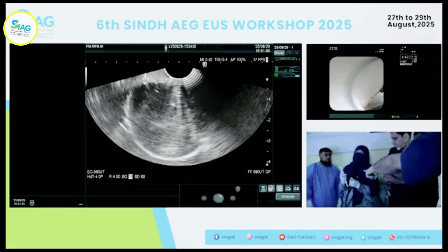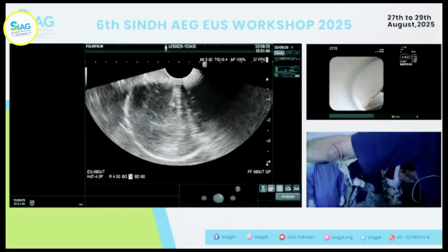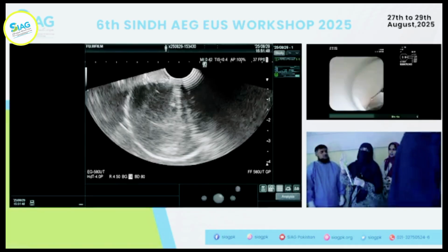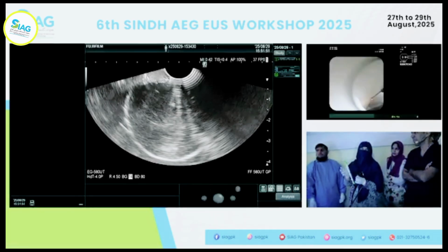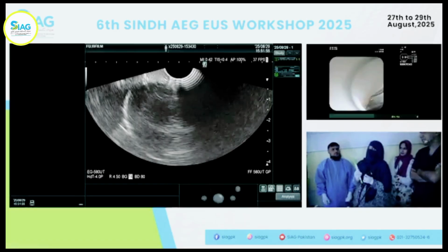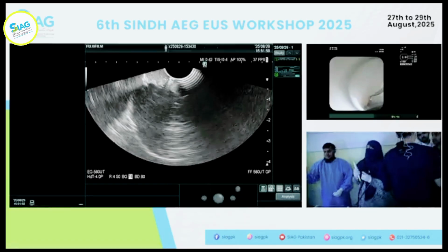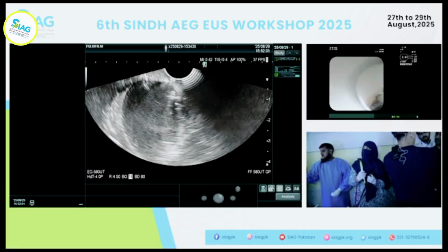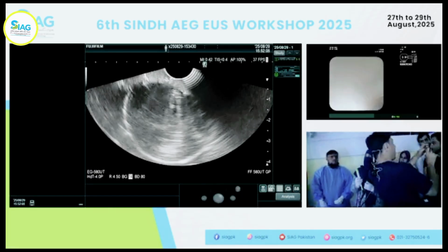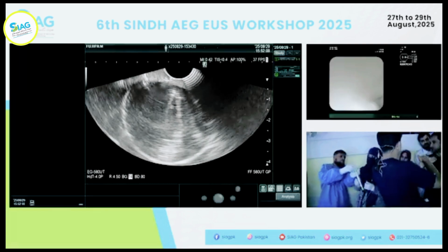This is a point. If you're not sure, you can measure your distance from there, measure that distance here, and lock it at that level. But otherwise, you'll see with practice you just know where to stop. That's an incredibly important technique. The reason it helps is in the therapeutic procedures a lot more, because if you are trying to puncture an intrahepatic biliary radical and you want to see how much is the throw, if it's too close to the mucosa, the gastric liver capsule.